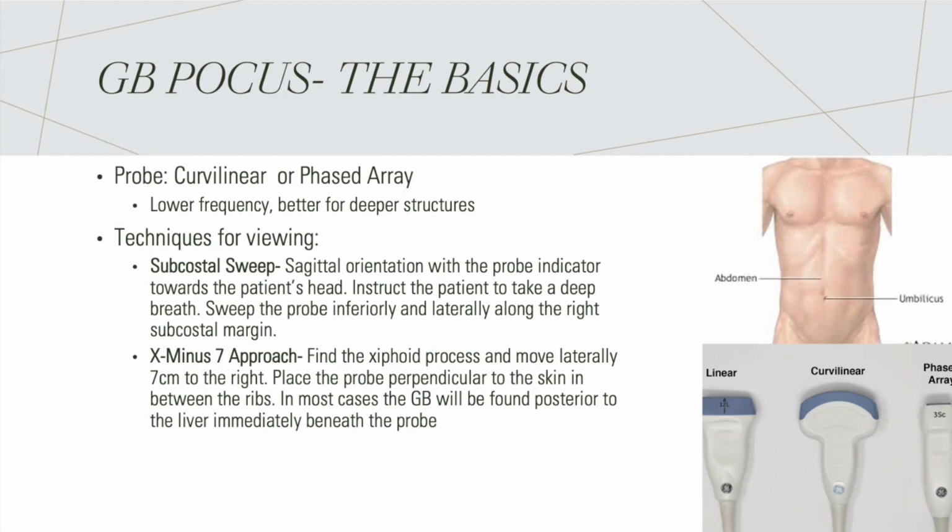There are other ways that you can help to get your gallbladder into view. You can use a technique called fanning, where your probe is in a horizontal rotation and you move the probe up and down. Or you can use something called rocking, which is moving the probe left and right, which may help to pull the gallbladder into view.